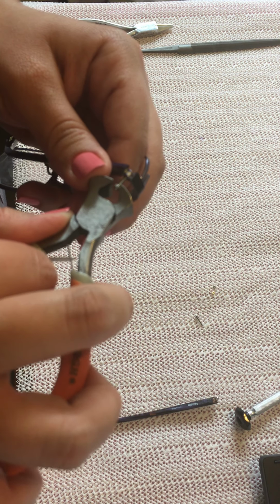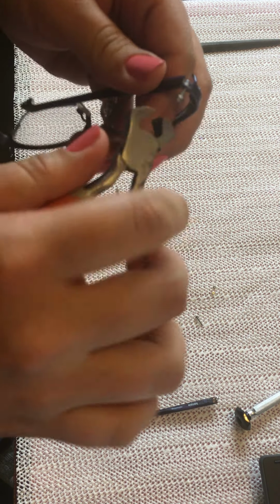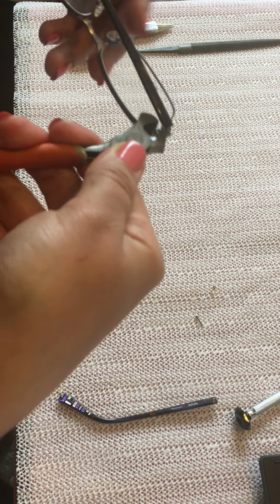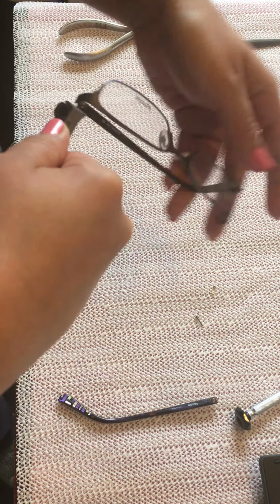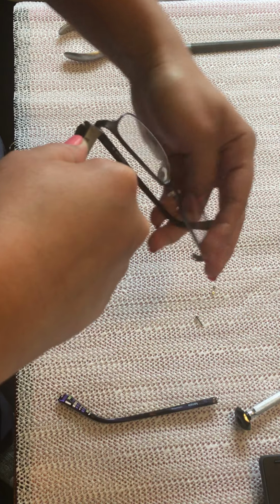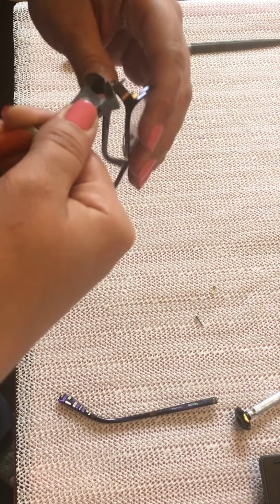So I'm gonna grab it from the top right here, and I'm just gonna start screwing away from me. So again, screwing away from me. Okay, so I'm gonna hold it in place, and then I'm just gonna rotate the actual frame. I think it's gonna be easier for me to get it all the way in, being careful. So it's all the way in now, all the way through the other side.